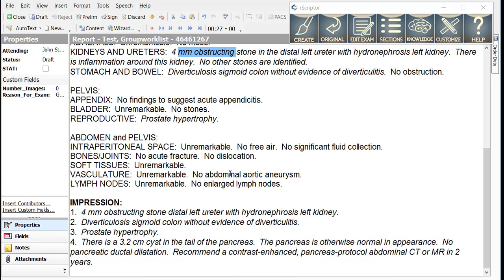It also becomes a more natural way to dictate when you become accustomed to this method, because you can decide at the time of dictating a particular finding whether that finding is important enough to go into the impression.